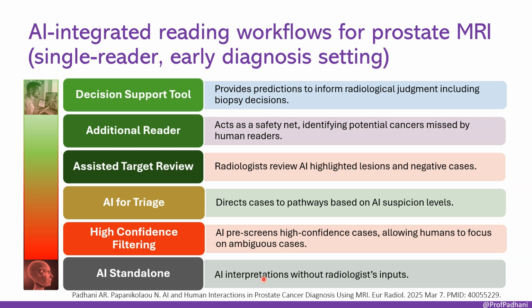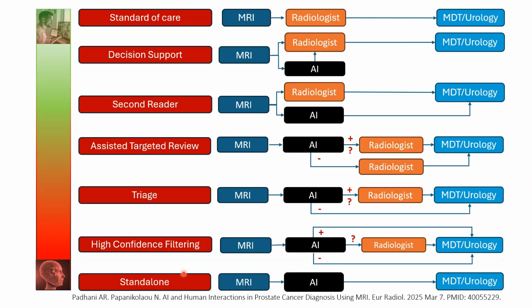Not yet. The slide referenced an upcoming publication in European Radiology that will apparently delve into these workflows in more detail, which will be worth looking out for. Good to know. And slide 34 had that visual workflow diagram showing where AI slots in alongside the radiologist and the MDT. Yeah, those diagrams can be quite helpful just to visualize the flow of information and decision points in each different model. All right, let's get really practical now.